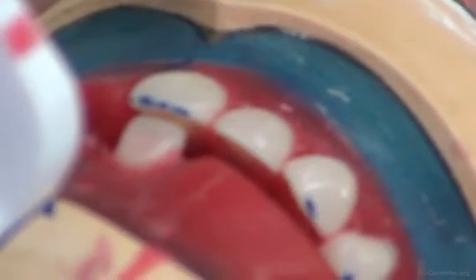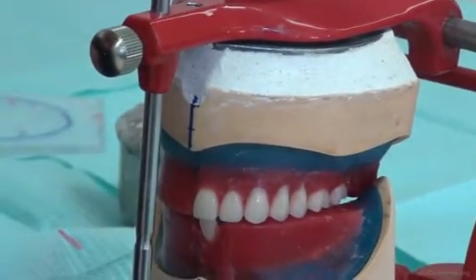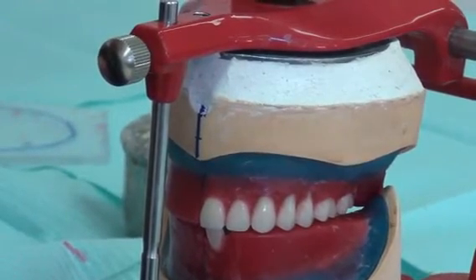Okay, so now we could go on and set the other tooth. We also should compare the midlines together. So we go back to our reference. Our reference was cast-to-cast midlines. So we need to make sure that the midlines of the lower and the upper are correct in the setting. Now we go to the second lateral incisor.